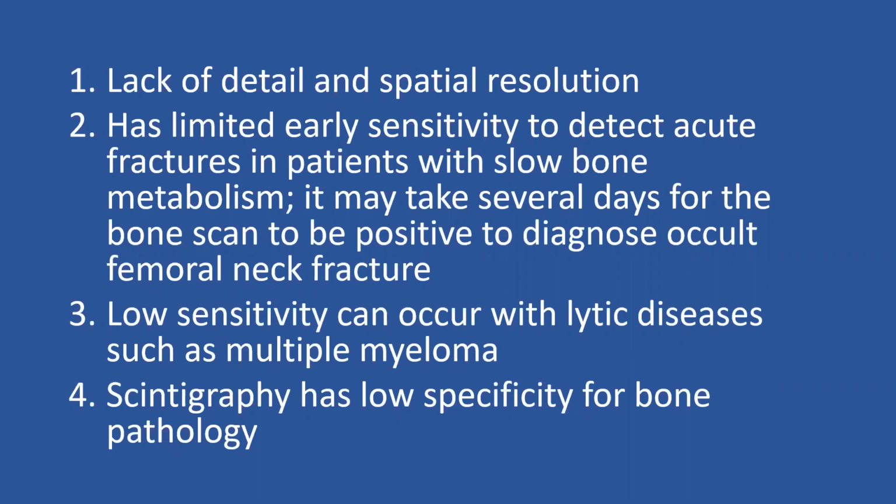It takes several days. Low sensitivity can occur with lytic diseases such as multiple myeloma. We know that these are negative on multiple myeloma, unless there is an area of bone formation. We know that scintigraphy has an affinity for increased blood flow and for immature bone formation. Scintigraphy has a low specificity for bone pathology. What about this? I want you all to listen.